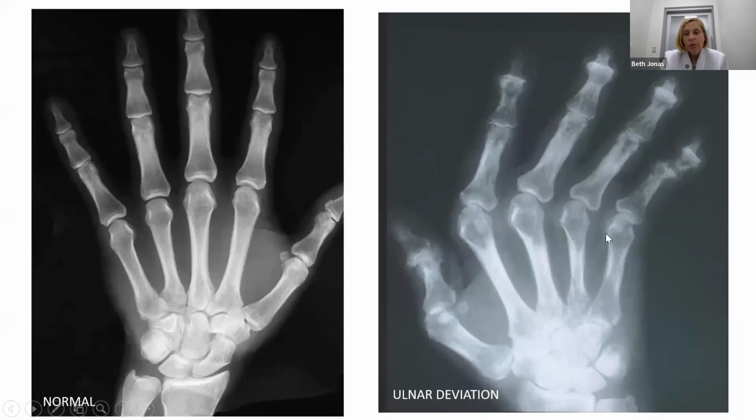Early on in the course of the disease, this may be reducible. So when you're seeing a patient, you may be able to straighten out those digits. But over the course of the disease, that may become increasingly fixed. Ulnar deviation is also seen in patients with lupus who have Jaccoud's arthropathy. That also may be reducible early on. So when you look at this film, you want to describe the deviation of the digits to the ulnar direction.